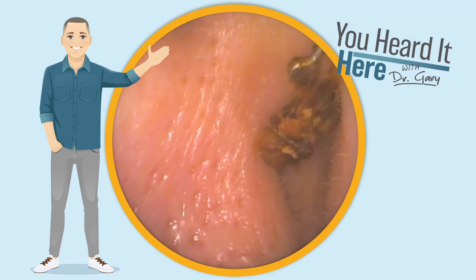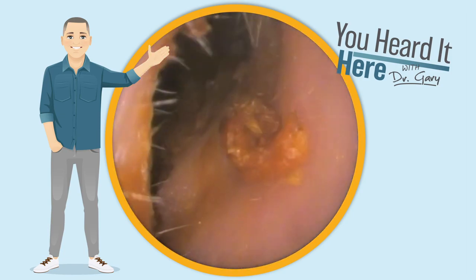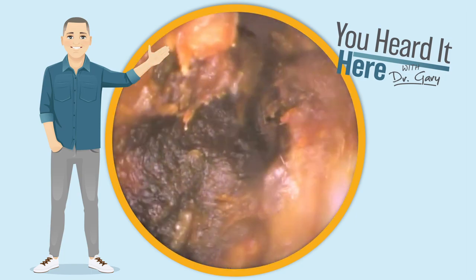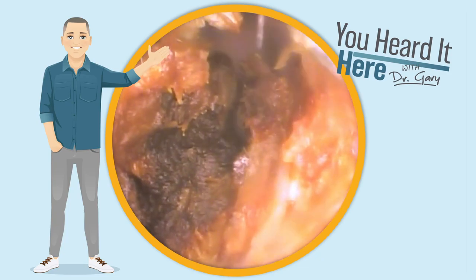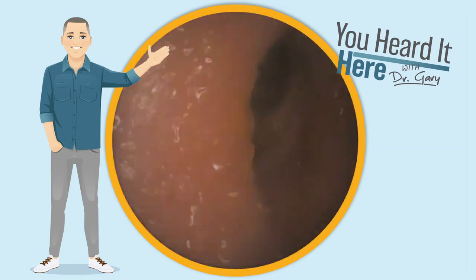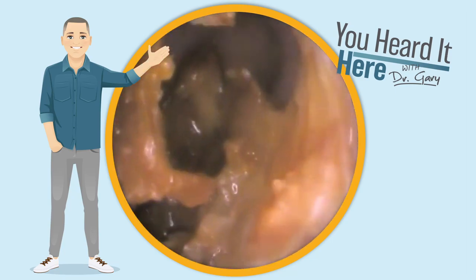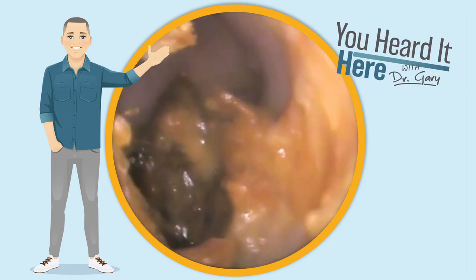This patient is suffering from fullness in the ears along with hearing loss. Once we got the other ear cleaned out, they reported immediate improvement in hearing. This wax is pretty soft and tacky, making it difficult to grab. We could have used suction, but this patient had suction done previously and did not enjoy the process or the increased volume. So we used a little bit of irrigation — you can see how the wax has changed colors.